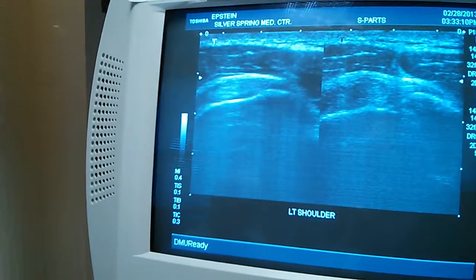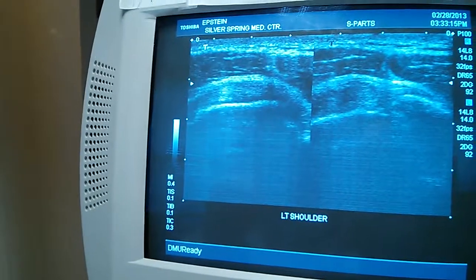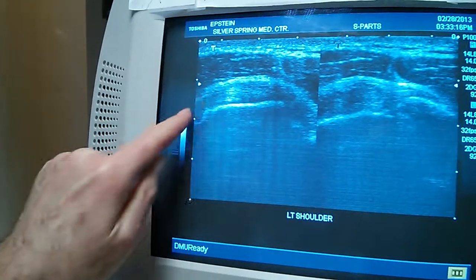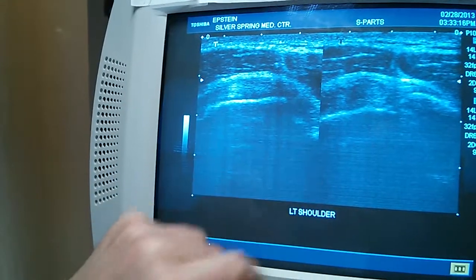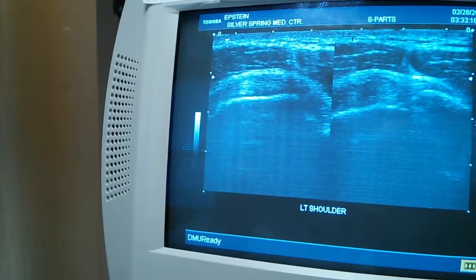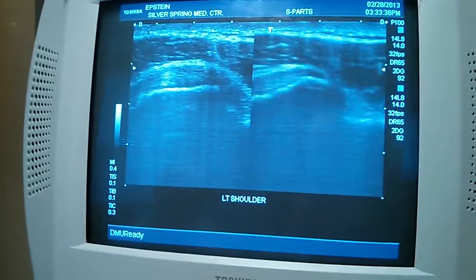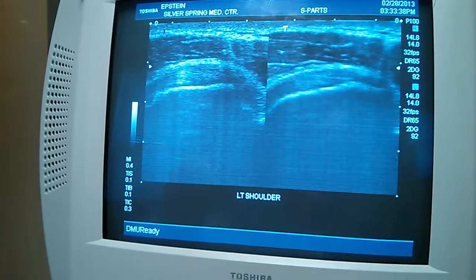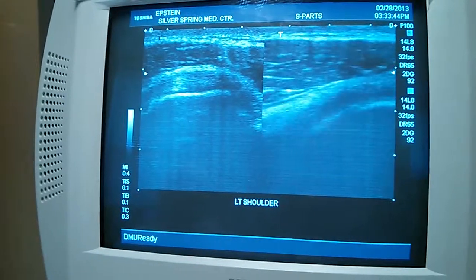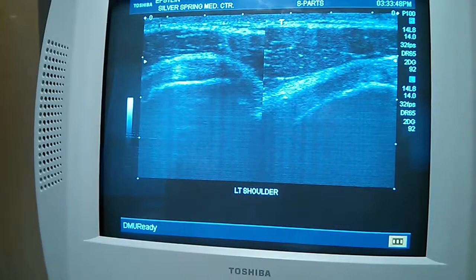All right, so let's see. I'm feeling a little bit of that strain. He knows what he's doing. So what I'm looking at here is a muscle. This is one of the small rotator muscles of the shoulder. There's the deltoid. This is one of the muscles that could get injured when you hang from a bar or whatever. You hyperextend your shoulder. Oh, that's what happened. And so there it is again. Here we're looking at it live. Oh, this is good stuff. So that muscle itself looks good. All right, that's what we want to hear.